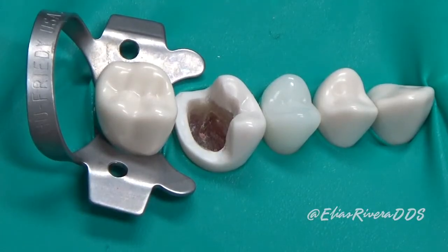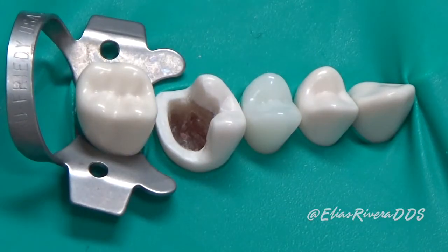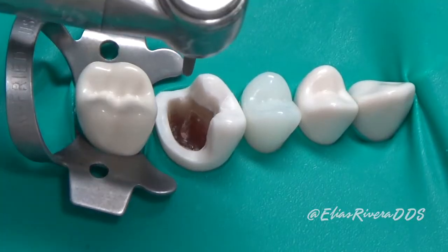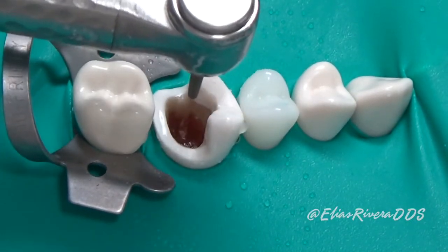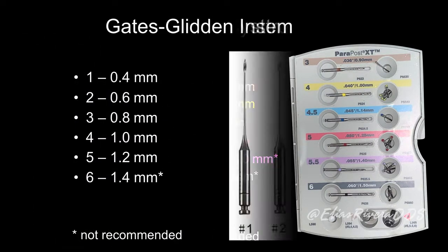Here's how our patient presented. Isolation with rubber dam is highly recommended to protect the root canal apical seal from contamination and to prevent the patient from aspirating an endodontic instrument. The next step is to remove any weak and unsupported tooth structure. For this exercise we're going to use the ParaPost system and Gates Glidden cleaning instruments.